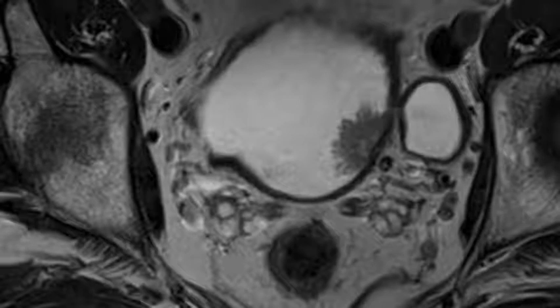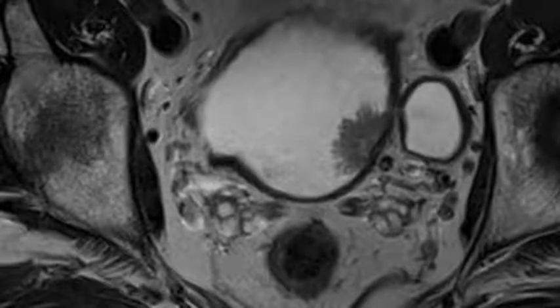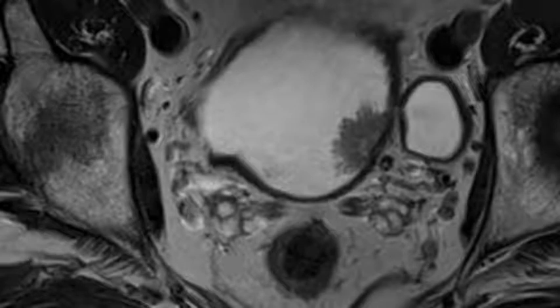To reduce this artifact, the bandwidth must be increased and the frequency encoding gradient changed to select the direction that least interferes with examination of the bladder wall adjacent to the tumor. MR imaging has been shown to allow more accurate staging of bladder carcinomas than CT because of its high soft tissue contrast resolution, which allows clear differentiation between bladder wall layers.